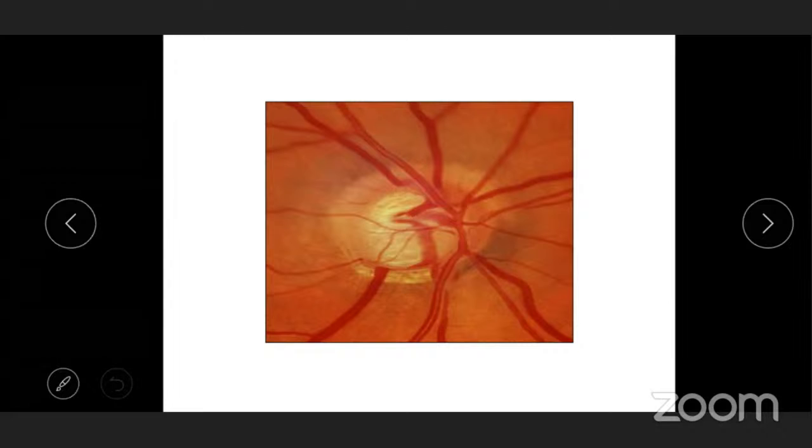So these are the important ones. This is not the comprehensive list. There are some soft signs which I purposely avoided just to keep the duration of the talk which was given to me. This is a classical glaucoma picture, and there's a large parapapillary atrophy all around, which is typical of glaucoma.